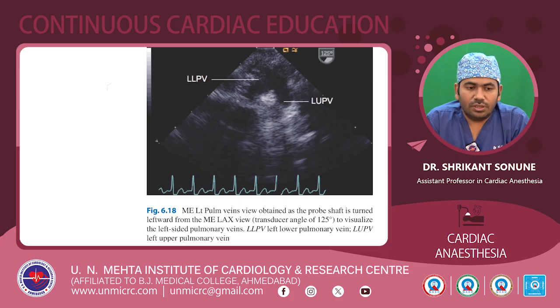This is an echo image in which we can see the view if the transducer angle is changed to 120 to 125 degrees from the mid-esophageal long axis view. After achieving the mid-esophageal long axis view, we have to rotate the multiplane angle to around 125 degrees and rotate the probe in the leftward direction. So we will be visualizing the left lower pulmonic vein as well as the left upper pulmonic vein.